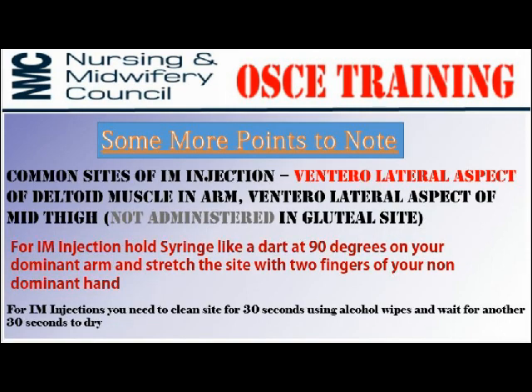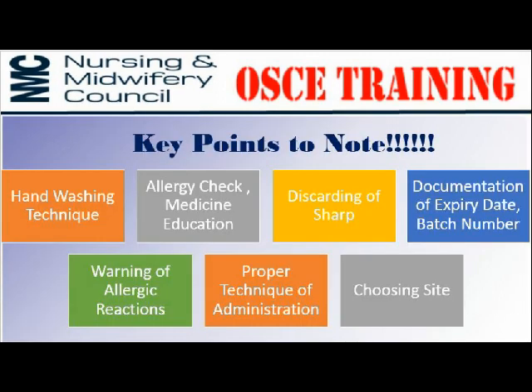Let me tell some more points to note in the case of injection skill. Common sites of IM injection are ventrolateral aspect of deltoid muscle in both arms or ventrolateral aspect of mid-thigh. You must know that intramuscular injection is not administered in gluteal site in the NHS. For IM injection, hold the syringe like a dart at 90 degrees with your dominant arm and stretch the site with 2 fingers of your non-dominant hand. For IM injections, you need to clean the site for 30 seconds using alcohol wipes and wait for another 30 seconds to dry.